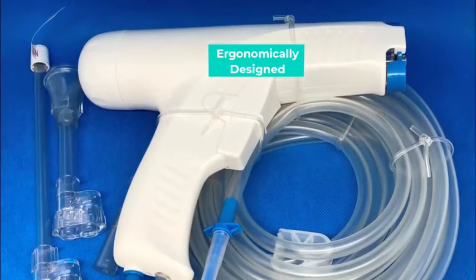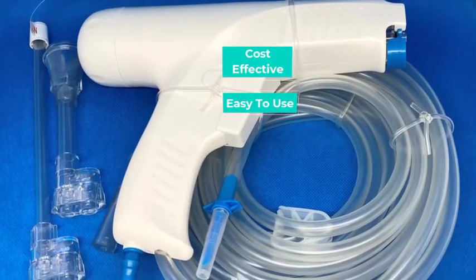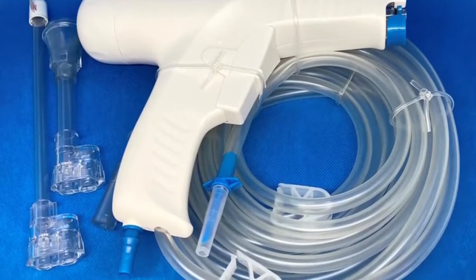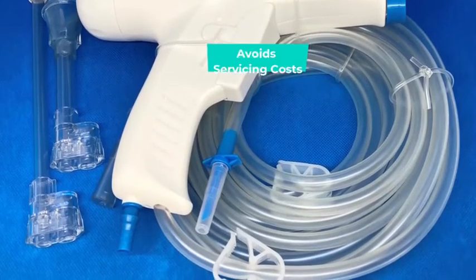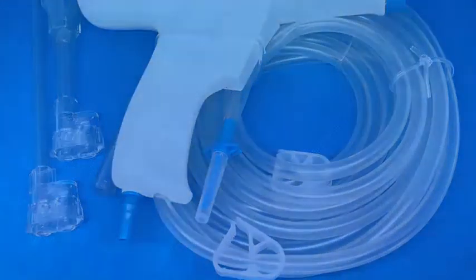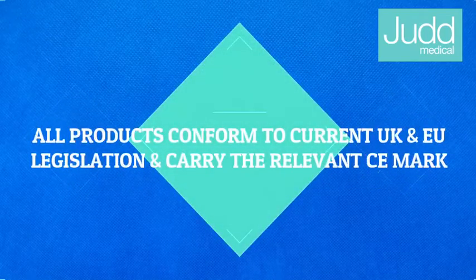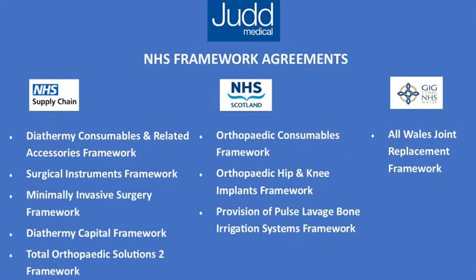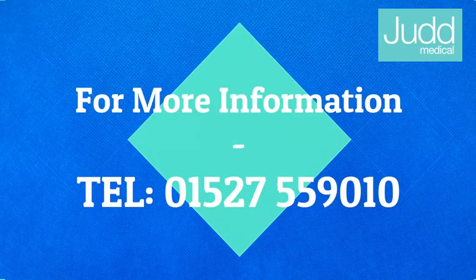Ergonomically designed to meet the needs of orthopaedic surgeons, this reliable, high quality, cost effective and easy to use product saves precious time, which is essential given the ever increasing time restraints placed upon today's surgeons. Unlike the reusable system, it eliminates the risk of infection from improper sterilisation between uses and avoids servicing costs.